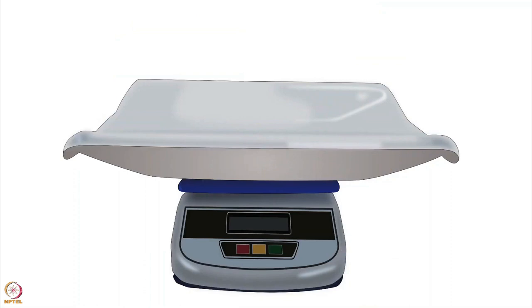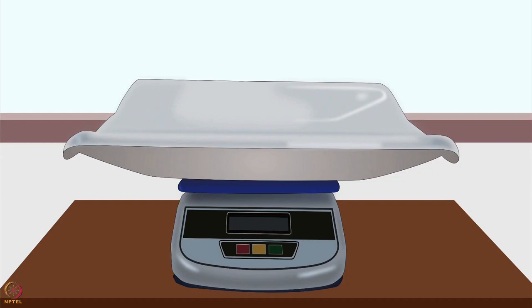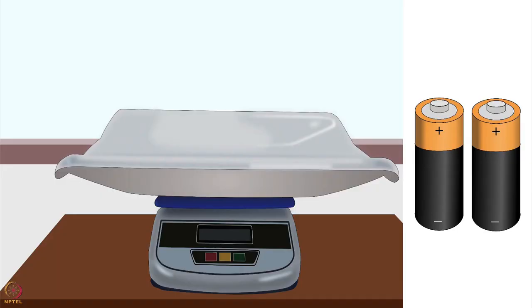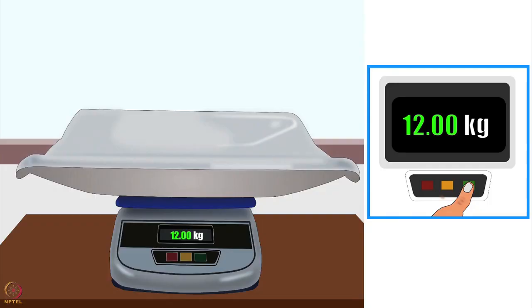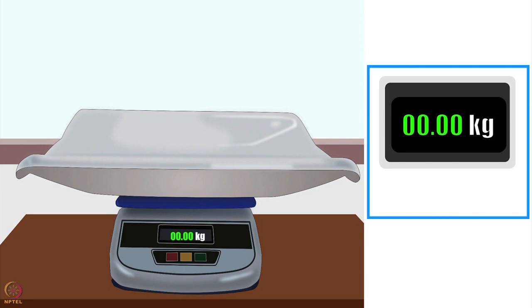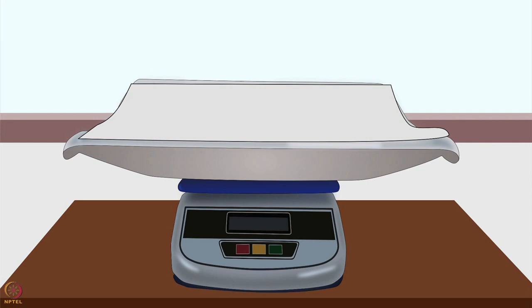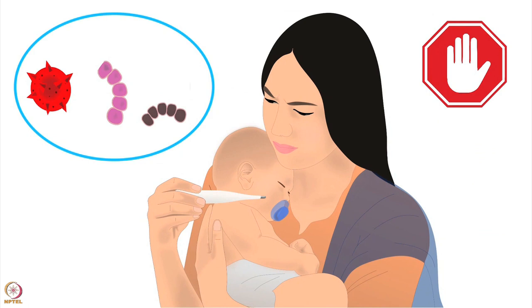Next, let us learn how to measure weight using a baby digital scale. Clean the tray and put the weighing scale on a flat stable surface like a table or platform. Connect the power plug, or if the scale runs on batteries, put the batteries in. Switch it on. The digital display will show a number — adjust it to zero using the knob. Some scales have automatic zero display. Place a clean dry towel or paper on the tray to reduce the chances of a drop in the baby's body temperature.